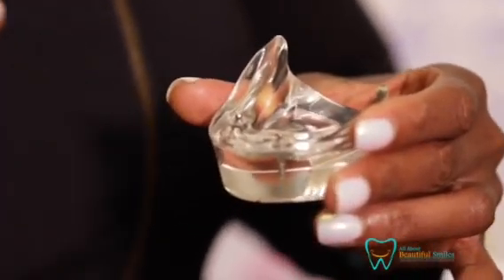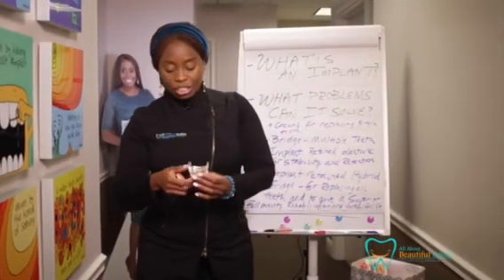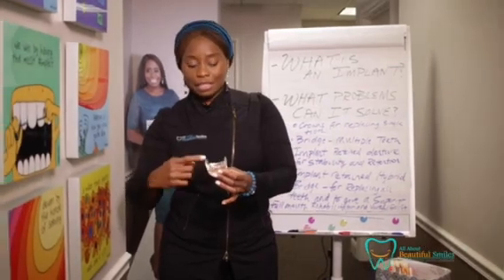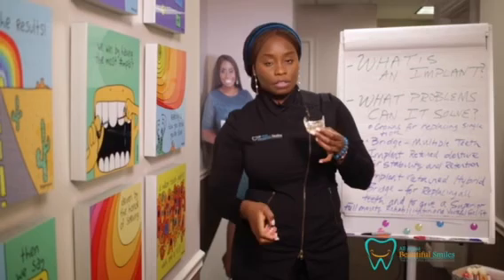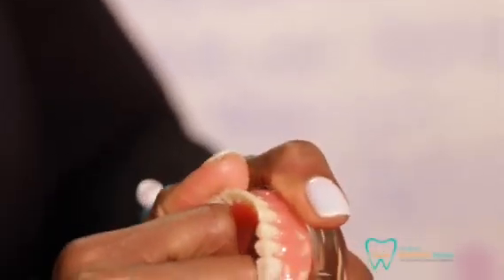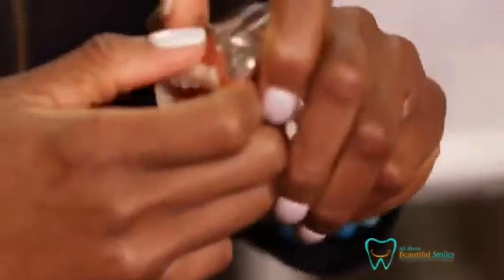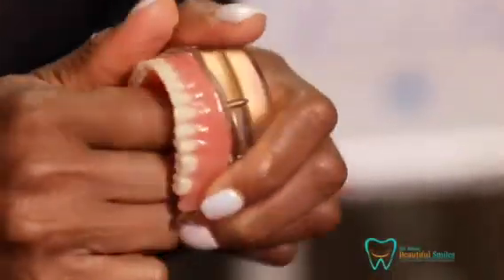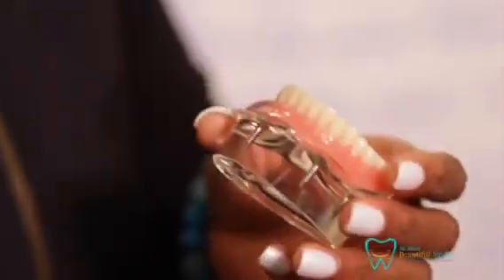I do at least four, because as you can see over here, on this other model, you actually see four implants, and you can see the anterior posterior spread of the implants. And as you can imagine, this really makes the denture so retentive, and oftentimes trying to get it off, you have to do that with a lot of intention, but that's what you want, right? So I typically go with at least four.